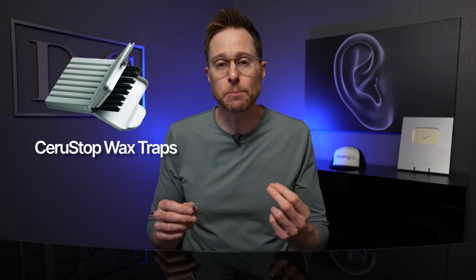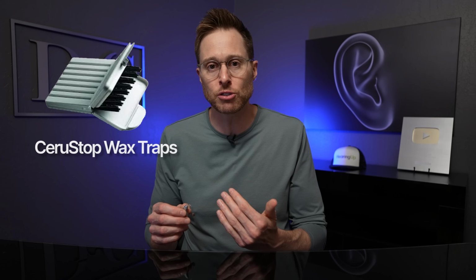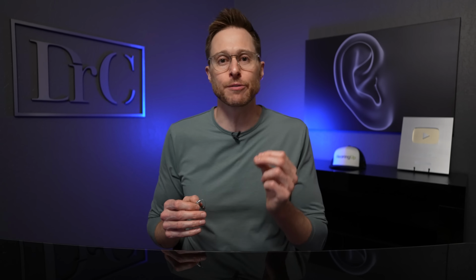And yes, the new SDS 6.0 receivers still use the traditional Cerustop wax traps for more convenient changing of your wax traps. They are not using the Cerushield anymore like you had with the SDS 4.0s.